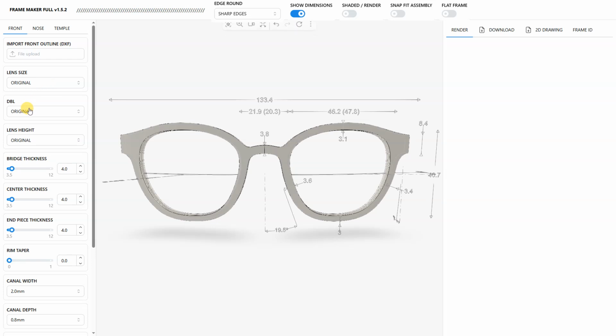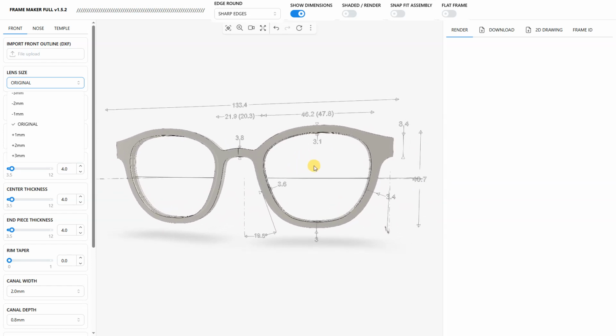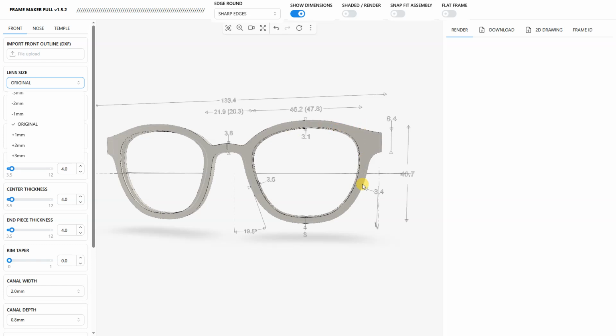size, the DBL, and the lens height all say original, and you can deviate from that original size by removing 1, 2, 3 millimeters or adding 1, 2, 3 millimeters, whatever. And that would be in this respect. If we have a boxed lens size of 46.2, it's the original size that the app picks up from your original DXF. So in this case, my DXF had a boxed lens size of 46.2.